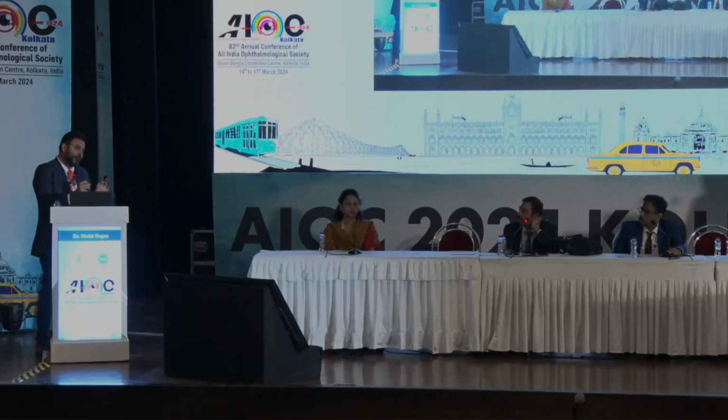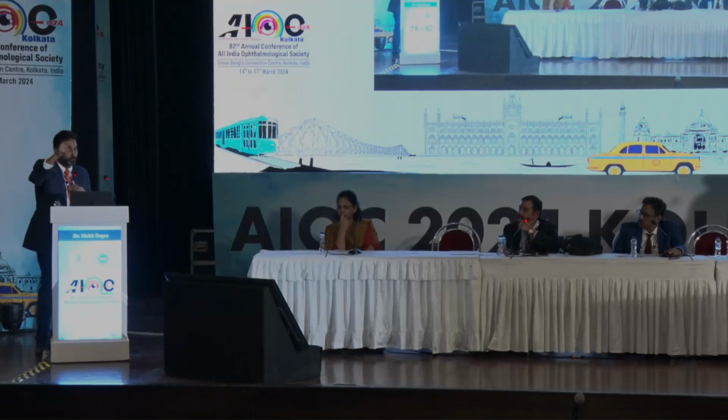Then also for teaching, I think it's very, very important if you have fellows, if you have people you want to teach when to do a buckle, when not to do a buckle, what is a buckleable kind of break, what is a posterior break, do you still want to try and use sponges? I think ultra wide field imaging falls short at this point in time. A fundus diagram with all of those 12 clock hours, those 3 circles, is a lot better because it will give you more information and also help in a teaching scenario.